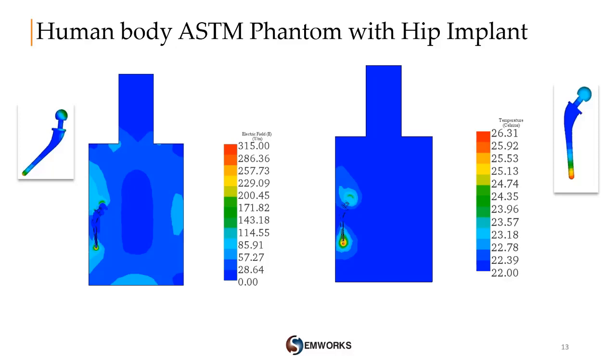The medical implant is characterized here by two hot spots at the top and the bottom of it, which may cause tissue burns in the case of a real biological body and could cause serious hazards. As we can see, the temperature rise follows the behavior of the electric field, where it is concentrated.